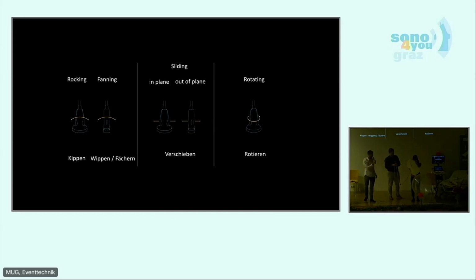Okay. So now do a little rotation. Clockwise. Stop. Perfect. And finally a fanning movement. And the other way. Yeah, exactly. More. And stop. Okay. We unfold you.